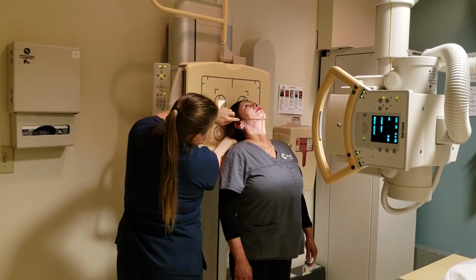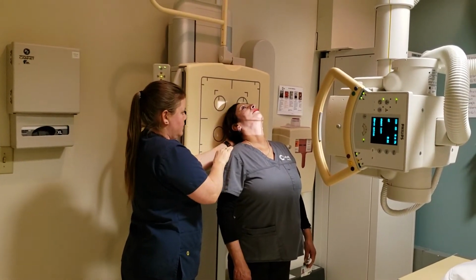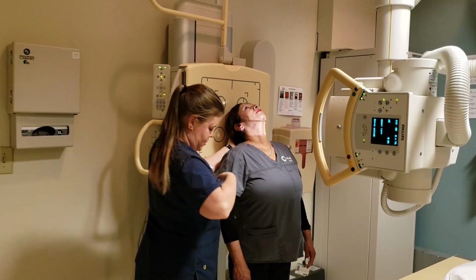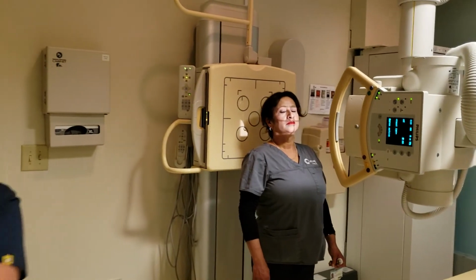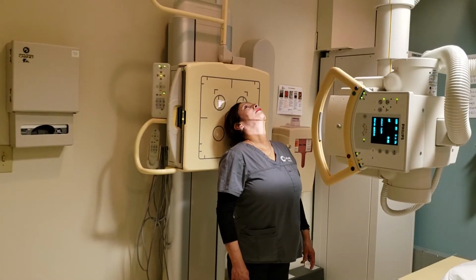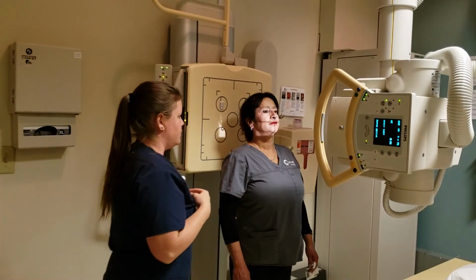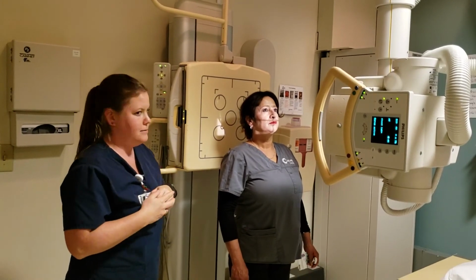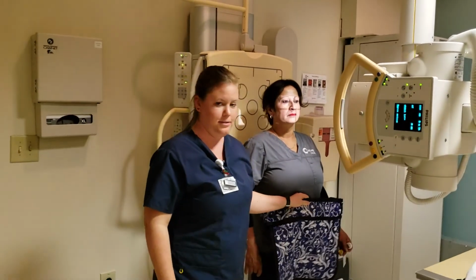So the central ray enters 3/4 of an inch anterior to the EAM, and then the IOML is parallel with the board. So, nice and centered. Cone in. I'll put my right marker up and have her hold still real fast. Throughout all of them, she's been wearing this shield. So, you're going to hold your breath, x-ray, you can breathe and relax. And this one's going to be done at 75 at 20. And obviously throughout all of them, she's been wearing this shield.